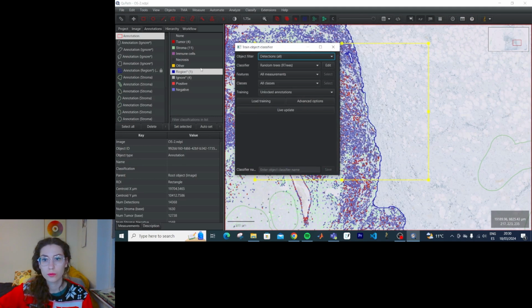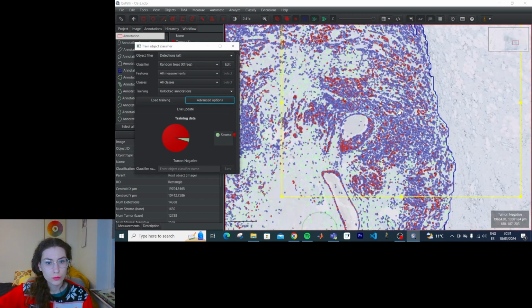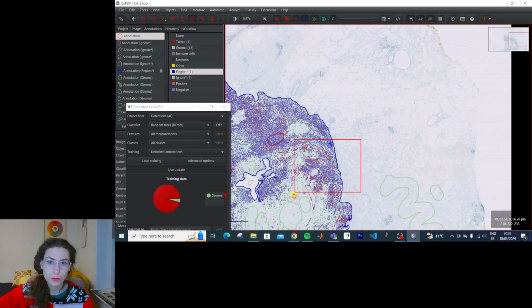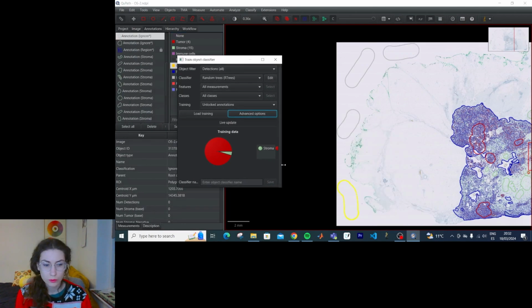Didn't quite like what it was doing, so I'm trying it again in a smaller area. It's possibly just that I wasn't seeing the green areas well enough because of a low contrast. So I just try again. It's fine to try again things when you're not happy with them. That's what this is for.